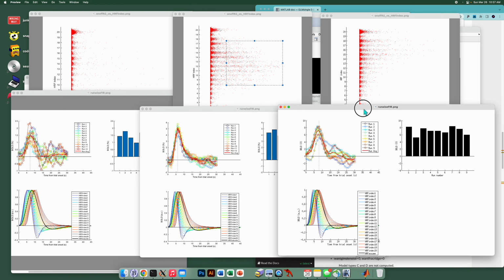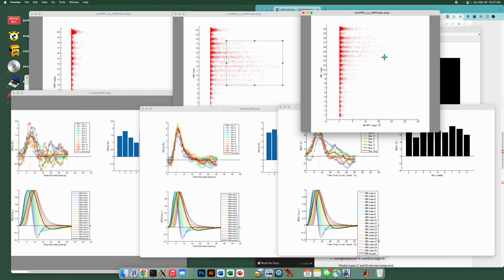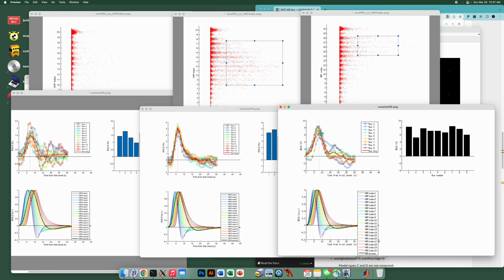And let's look at one last example. This is the third data set. Here we notice the HRF indices are quite delayed. In this data set, there's a few strange things happening. I guess you could poke and do some further digging to see what's responsible maybe for this very strange time course. So this would be the second run. So maybe something happened in that run, or there's an artifact or something happened. So that's not a good sign.